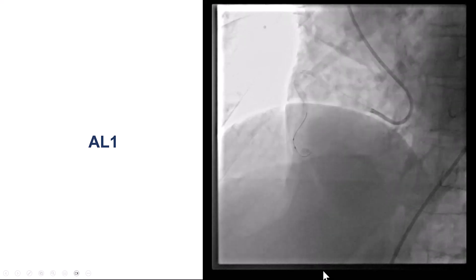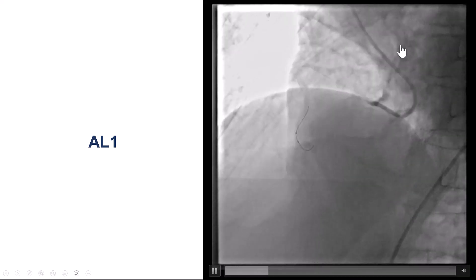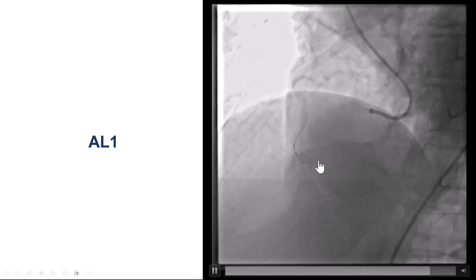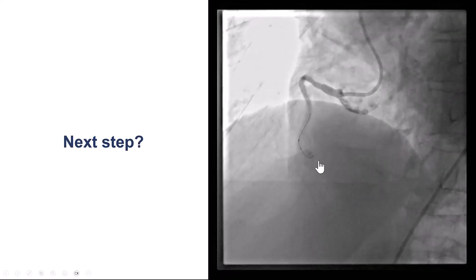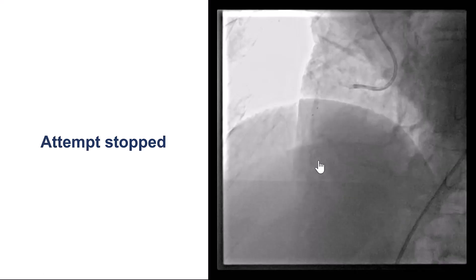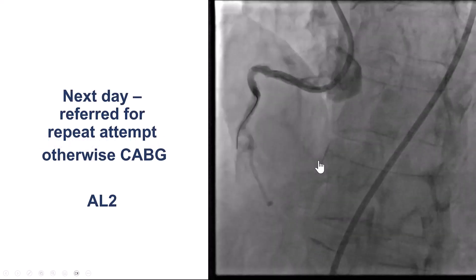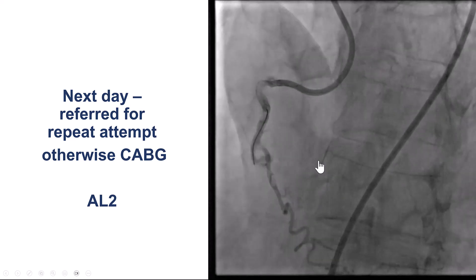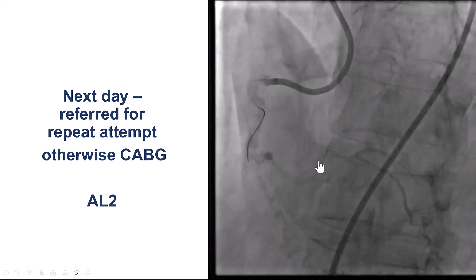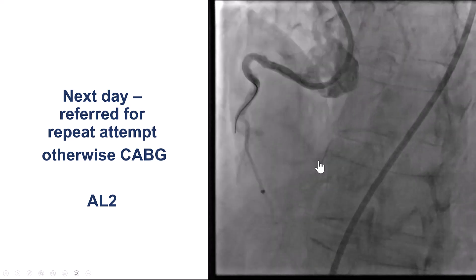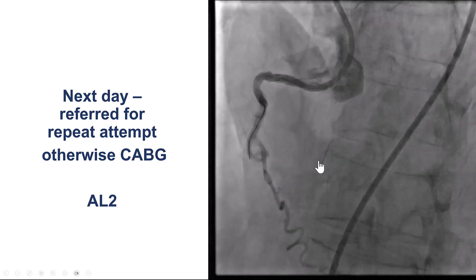After doing that, there was an attempt to open the right coronary artery using an AL-1 guide through femoral access, with an over-the-wire balloon. There was poor support with the over-the-wire balloon. This could not be re-canalized, so the attempt was stopped and the patient was referred for surgical evaluation. The surgeons accepted to do surgery; however, they recommended a repeat PCI attempt, and this is when the patient came to our lab.